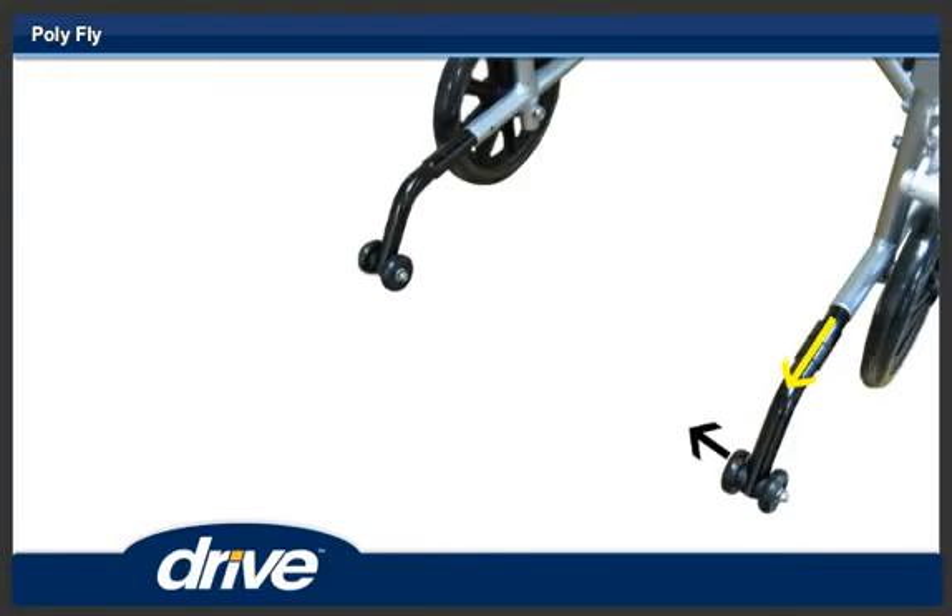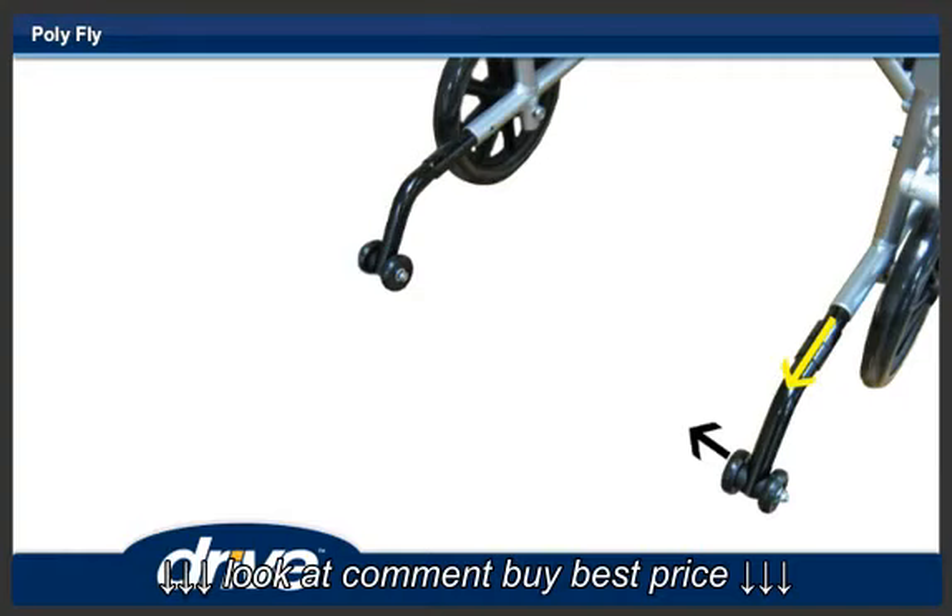To disengage the anti-tippers, pull the anti-tipper rearward and swing 180 degrees until it locks in the upward position. Repeat for the other anti-tipper.